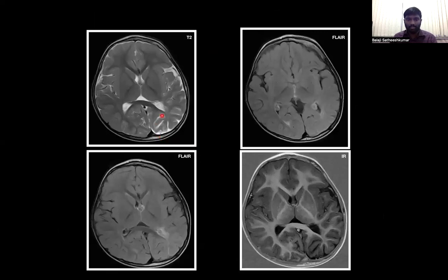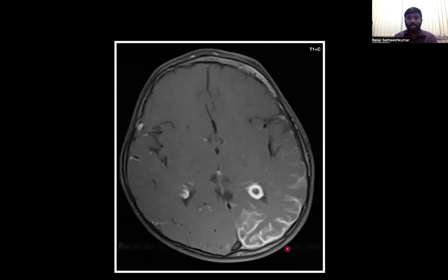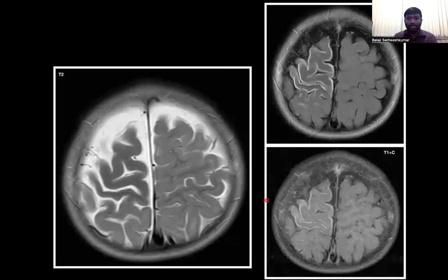Moving on to the next case, here we see prominence of the cortical sulci along with enlargement of the subarachnoid space on T2 image, along with subtle FLAIR hyperintensity along the cortical sulci in the left parieto-occipital lobes, mild thickening of the ipsilateral choroid plexus, and on post-contrast study there is serpentine pial enhancement along the cortical sulci and gyri of the left parieto-occipital lobe with thickened and enhancing ipsilateral choroid plexus, suggestive of Sturge-Weber syndrome. The next case similarly shows prominence of cortical sulci with pial enhancement along the cortical sulci and gyri of the right frontal parietal lobes, suggestive of right-sided hemiatrophy with pial angiomatosis in Sturge-Weber syndrome.